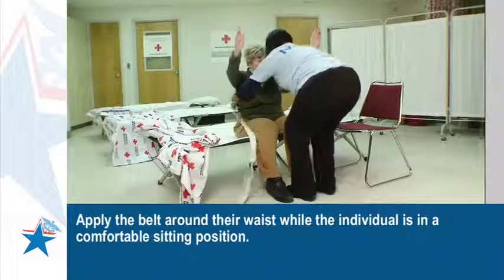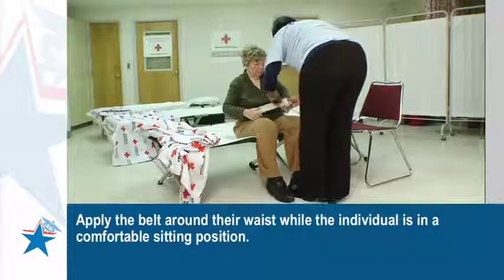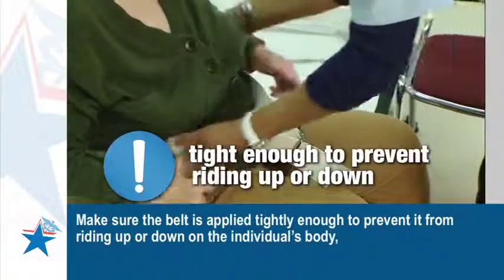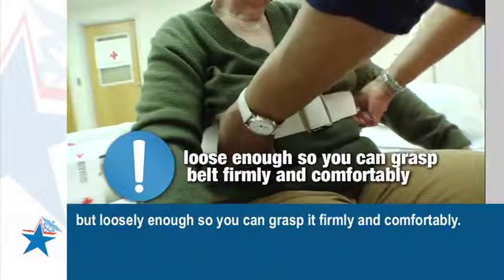Apply the belt around their waist while the individual is in a comfortable sitting position. Make sure the belt is applied tightly enough to prevent it from riding up or down on the individual's body, but loosely enough so you can grasp it firmly and comfortably.